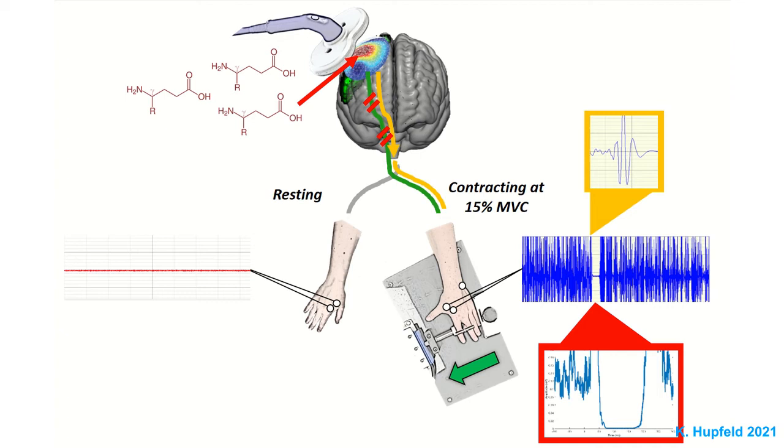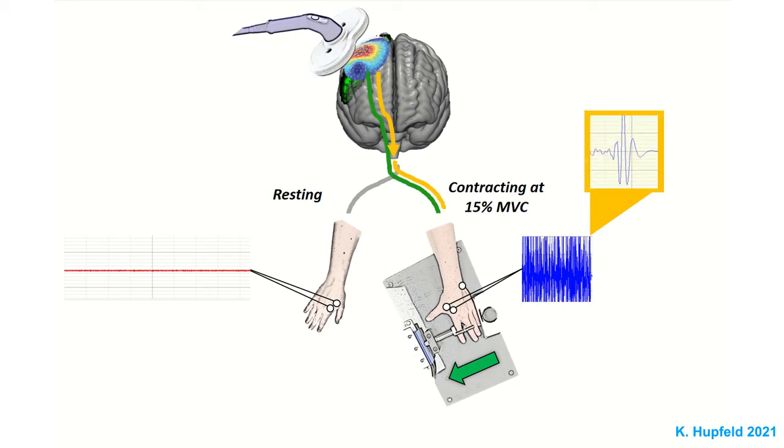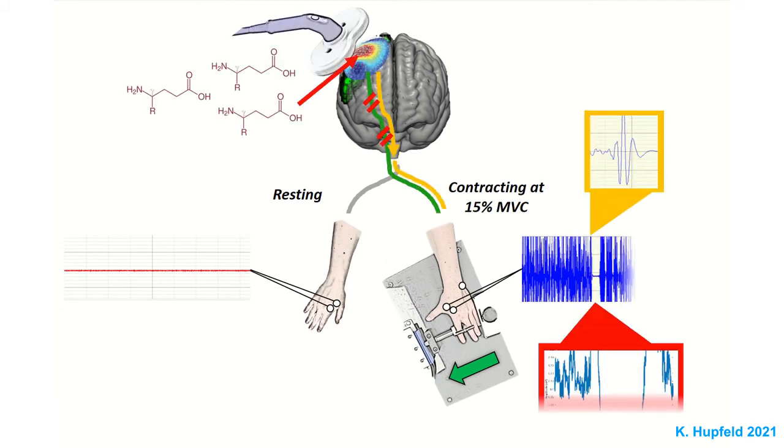You can see the silence in the unrectified EMG in bright blue and in the rectified EMG in the red box. This silence typically lasts for about 50 to 200 milliseconds, and then after that period of silence, regular EMG activity resumes. So essentially, this cSP, or cortical silent period that we've elicited, provides a measure of the motor system's functional GABAergic response to the TMS stimulus.